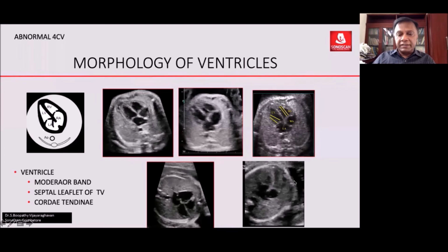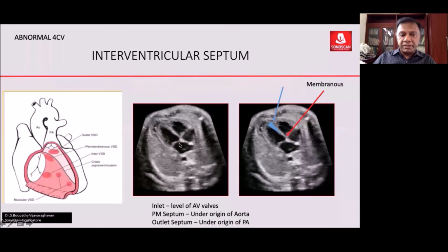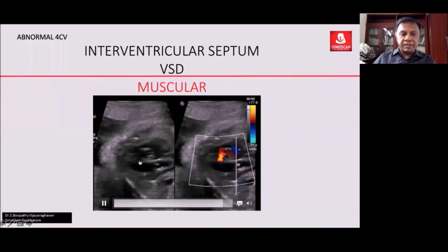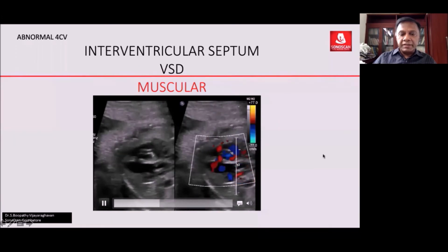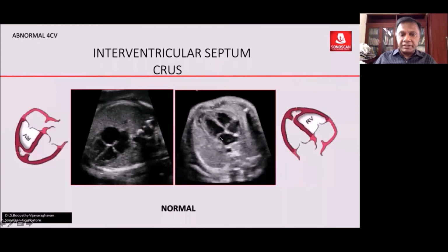So when you see like this, then you have to definitely use an anterolateral approach, because that is perpendicular to the beam, and it is broader towards the apex and thin towards the AV groove. So this is showing the muscular VSD. In grayscale it is seen, and there is bidirectional flow in the muscular VSD. It is an offset. It is not at the same level.